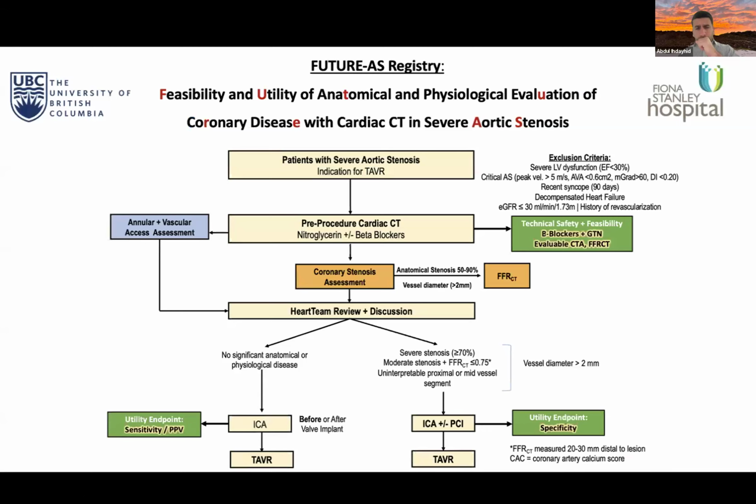And so we've decided now to extend that further, and this is a study that I've been doing along with my good colleagues, Professor Jonathan Leipzig and Dr. Stephanie Sellers, where we ran an international multi-center registry to expand this further. We gave patients who were having their routine pre-TAVR CT nitrates plus or minus beta blockers. We looked at their coronary arteries and did an 18-segment read.